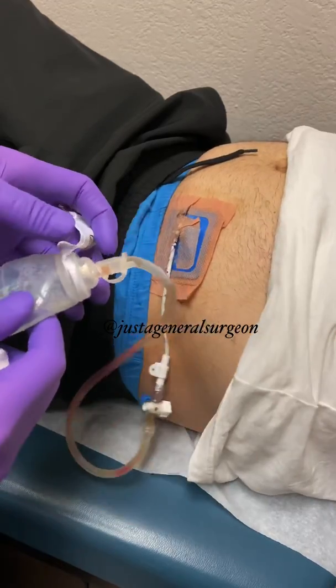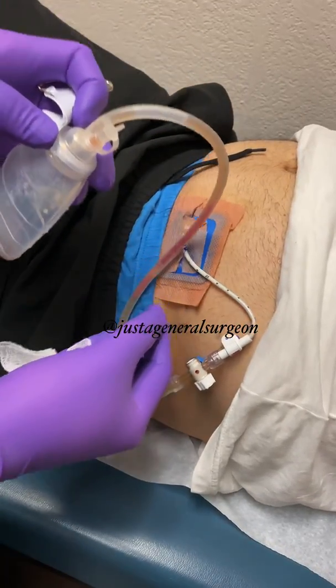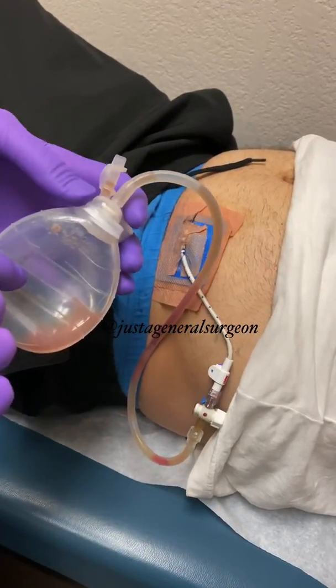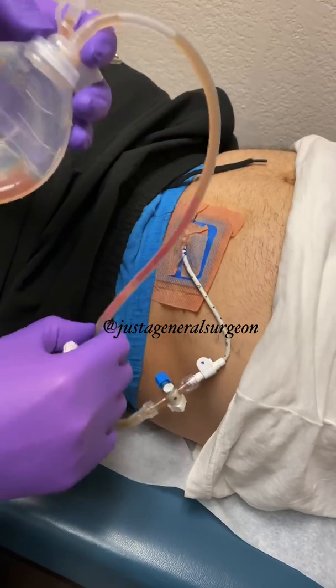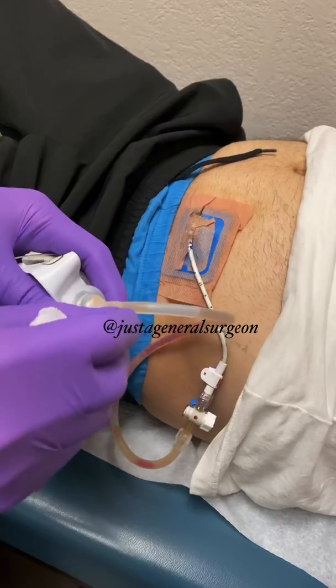The first key is — we've already taken out all the stuff stuck to him except for the bandage — but you want to make sure there's no suction, because the whole point of this drain is that it creates bulb suction. So let me just take that off right here.